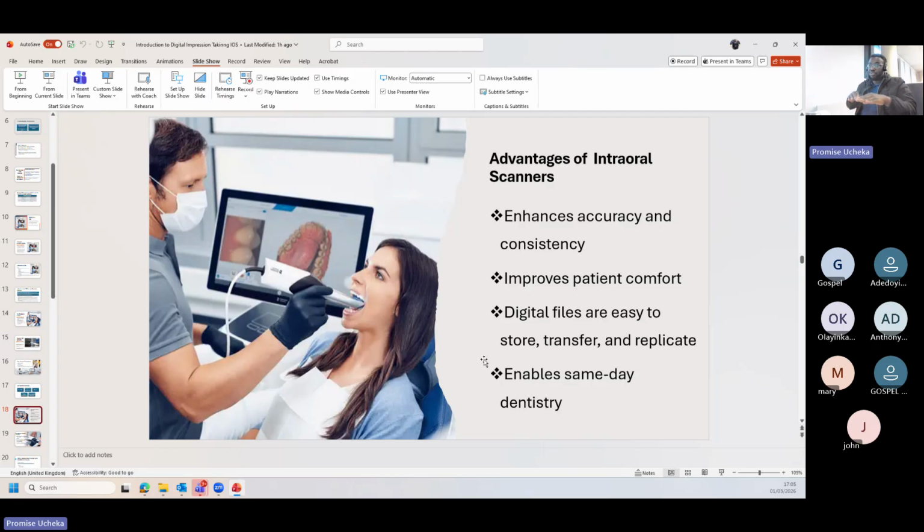But if for some patients you use intraoral scanners, and another time you don't, then your work might not be consistent. You have good success today, and tomorrow you are struggling again, and you go back to having some success and some failures in your clinic. So consistency when it's required, that's one advantage.